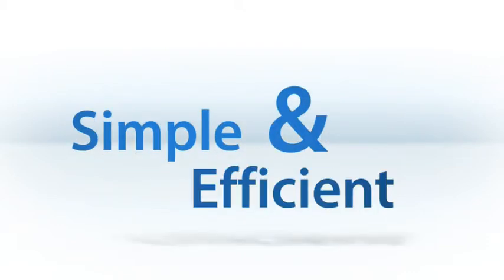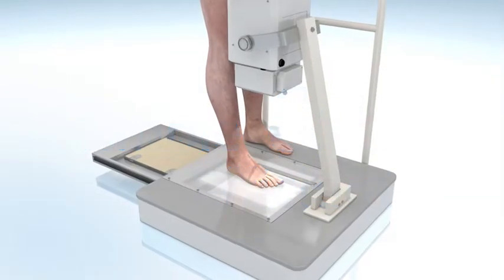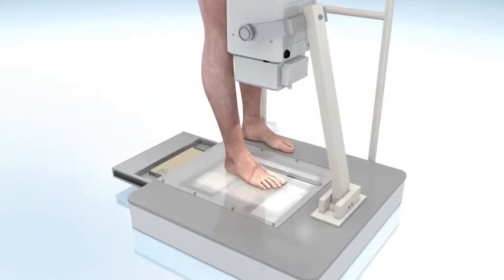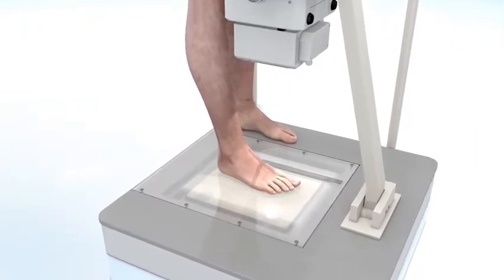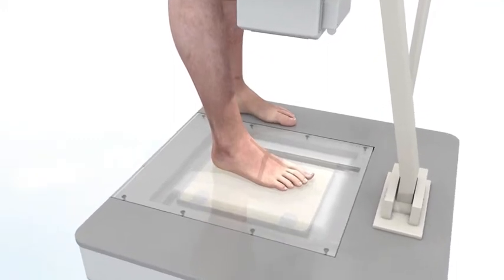The ScanX 12 SE workflow is simple and efficient. The 10 by 12 inch imaging plate and cassette can be placed within your ortho-poser as you would with your traditional analog X-ray film. The reusable plate and cassette is placed either under the foot for the weight-bearing AP or oblique view, or in the slot for a lateral or ankle view.